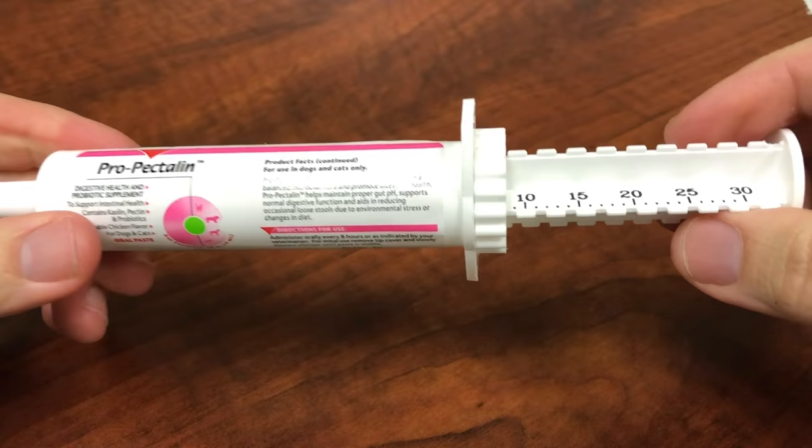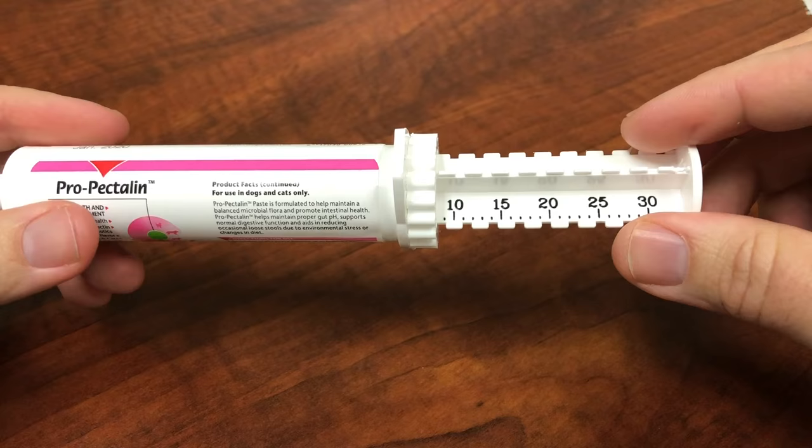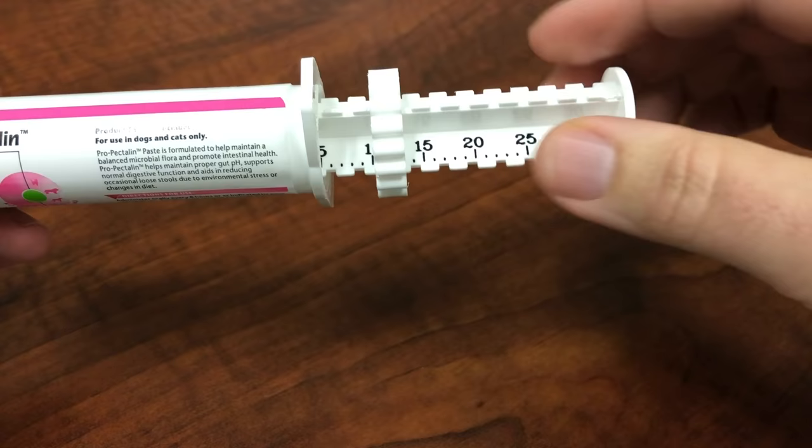If you want to give another administration, we are going to show you how to use the same syringe for an additional administration 8 hours later or as recommended by your veterinarian. Twist the dial counterclockwise this time to the 10 mark on the syringe, making sure that the dial is to the right side of the hash or the number.